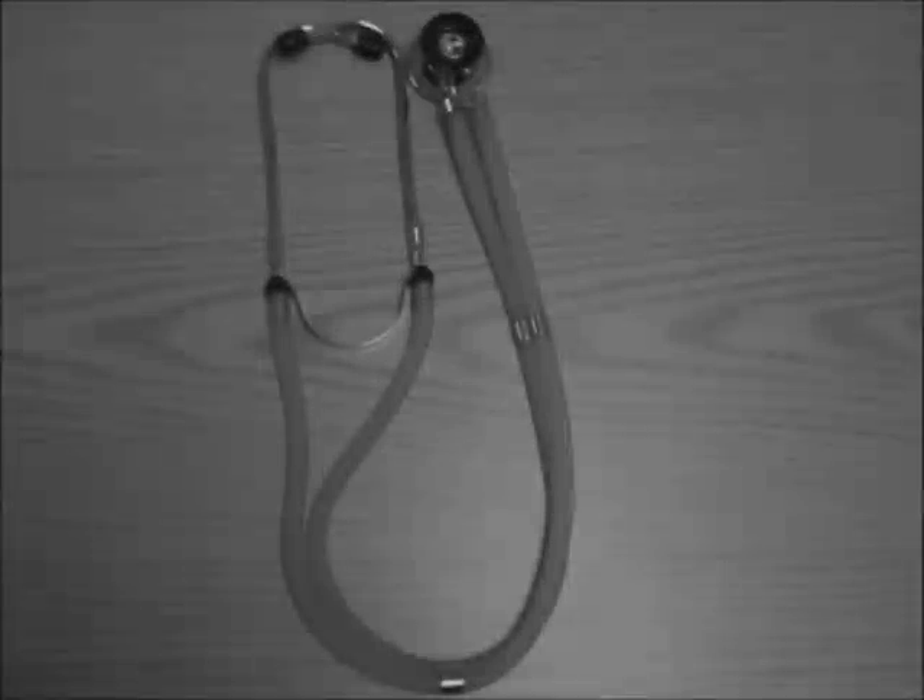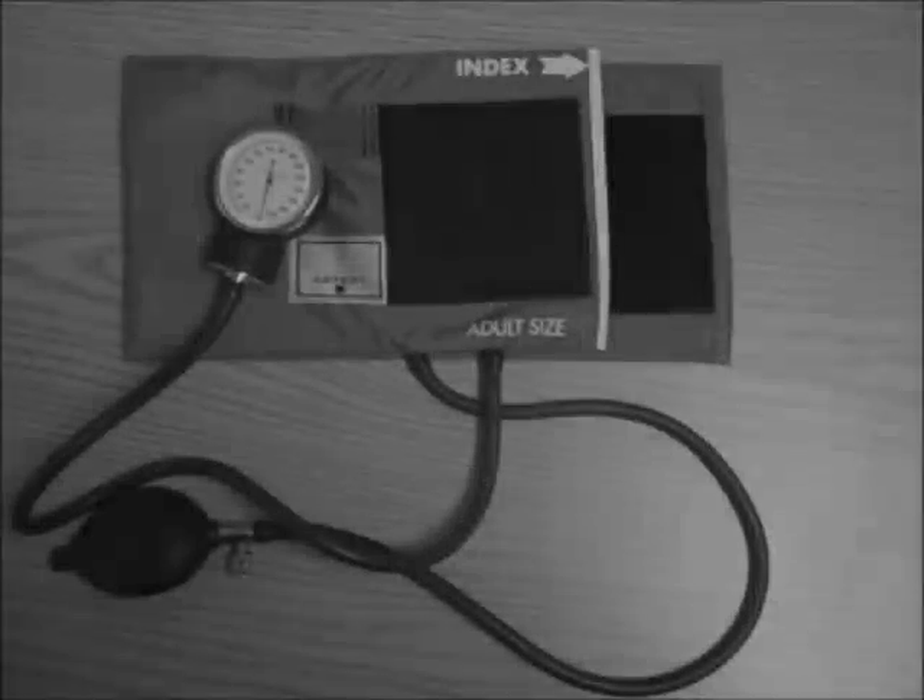We are pre-nursing students at the University of Texas at Arlington and today we're going to show you how to take a patient's blood pressure. What you'll need to take your patient's blood pressure is a stethoscope, a blood pressure cuff, a chair, and of course your patient.